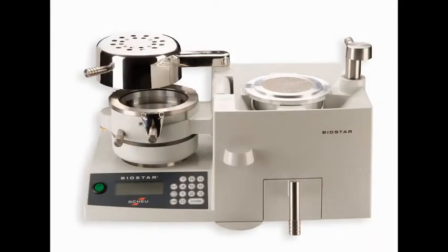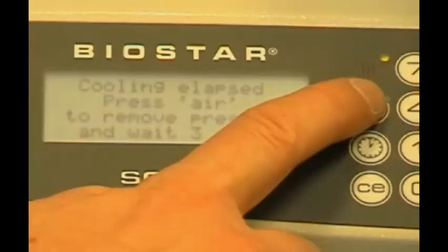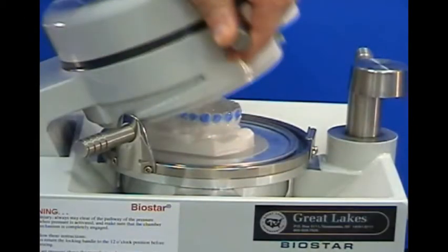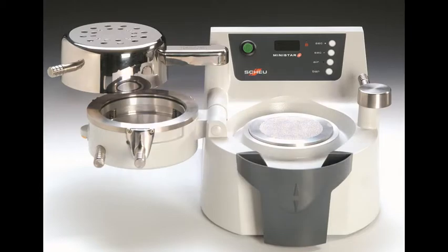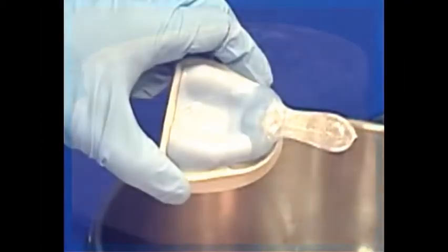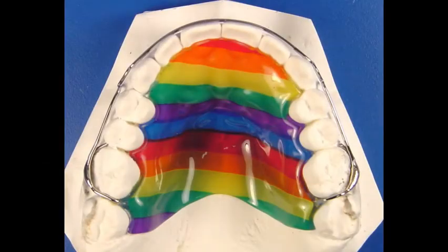Most of the technique videos in our Resource Center feature the BioStar, because that's what we use in our commercial lab at Great Lakes. For most dental practices, the MiniStar is ideal. You can use the MiniStar to fabricate the same extensive variety of appliances that you can with the BioStar.